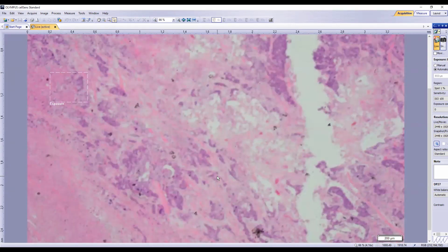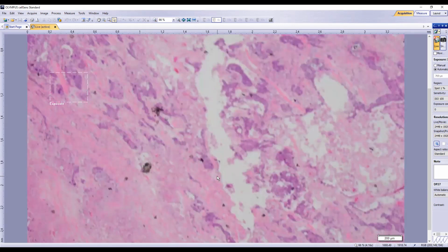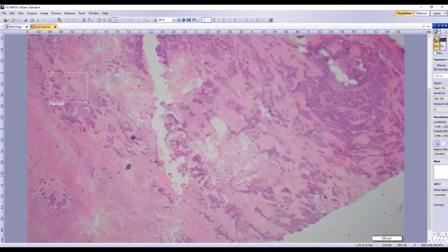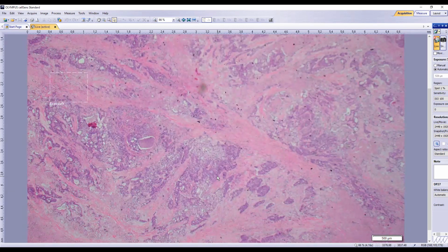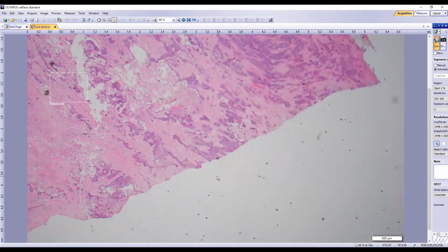Okay, this is number 9, a 55-year-old male with a 4 centimeter pancreatic body mass. And from low power, you can already see that this doesn't look right. It's abnormal, so it's tumor, right? Yeah, sure. The question is, how would you morphologically classify this tumor?